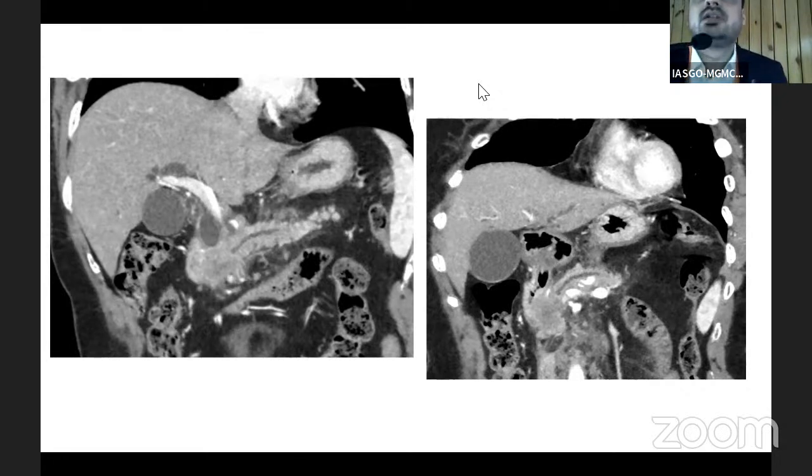Regarding cystobiliary communication, one useful investigation is MRCP. If you find contrast or bile inside the highlighted cyst, that points to a biliary communication. Okay. Thank you.